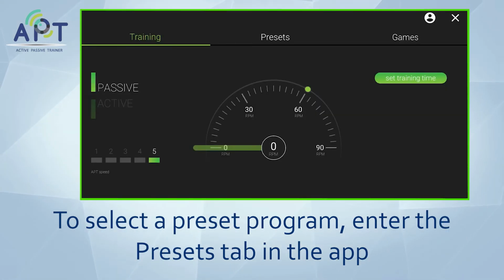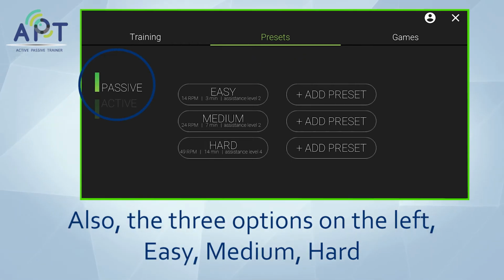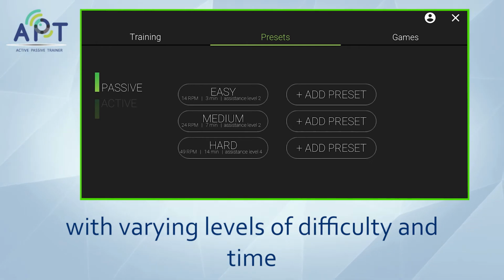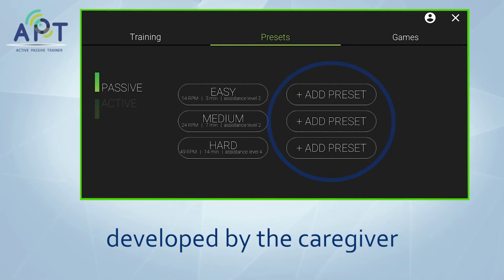To select a preset program, enter the Presets tab in the app. Note that on the left side of the screen, you need to select Passive. Also, the three options on the left, Easy, Medium, and Hard, are preset programs that we developed for you with varying levels of difficulty and time. The right side includes an option of adding a preset program developed by the caregiver.